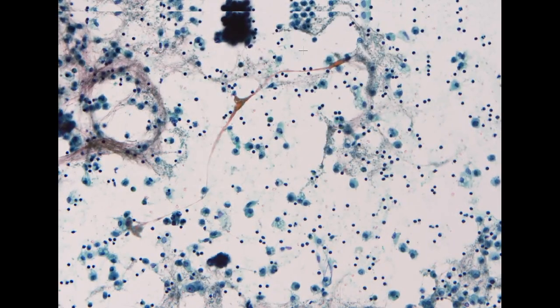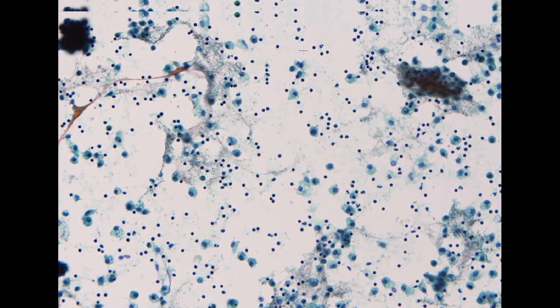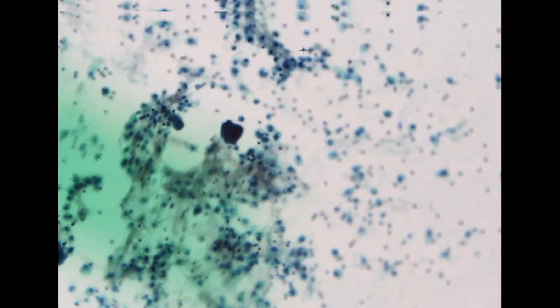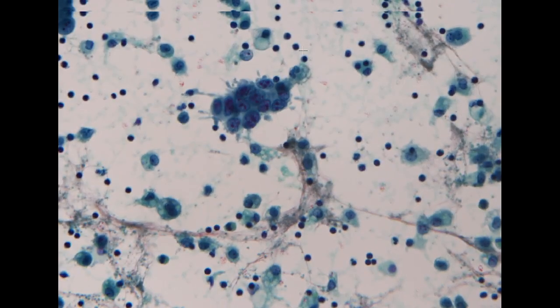So this is again relatively not so easy to screen, because of this background inflammation, and also because the cellularity is kind of scant. So I think the most convincing focus would be this one.